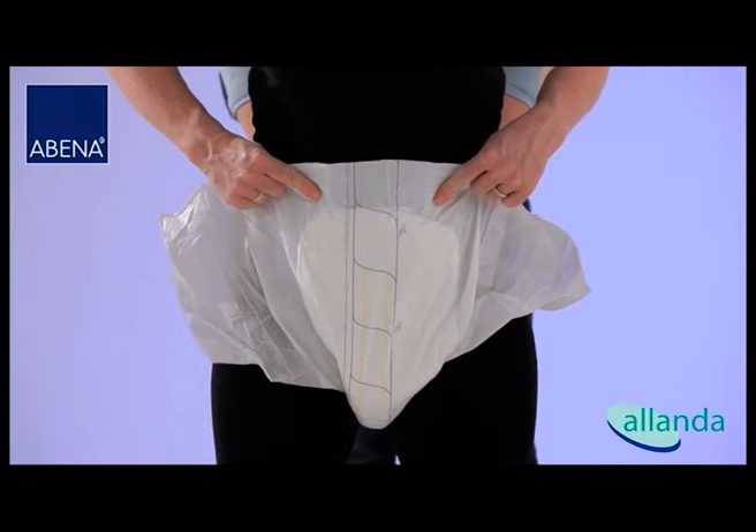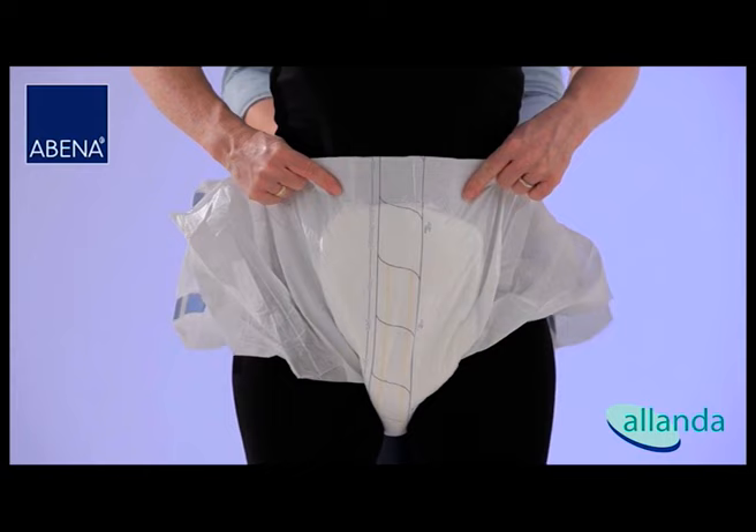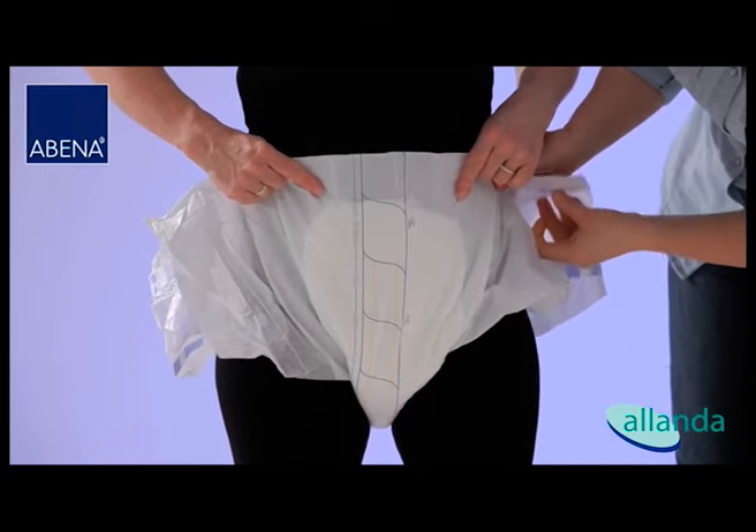If possible, ask the user to help by holding the front of the product. Spread the side panels of the brief to the right and the left so that it will be easy to wrap them around the hips.